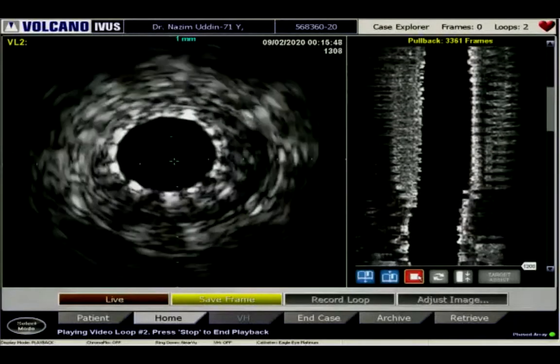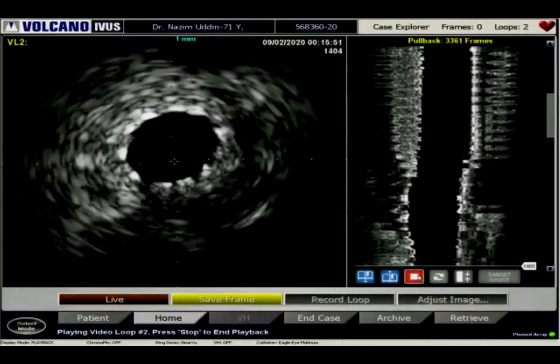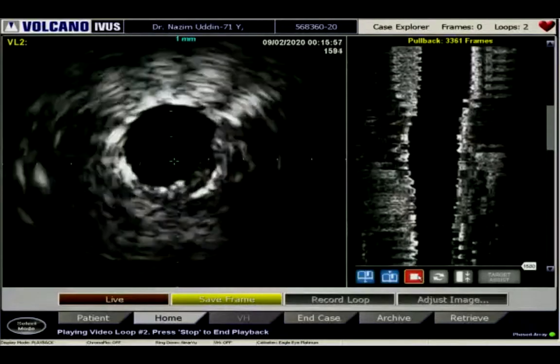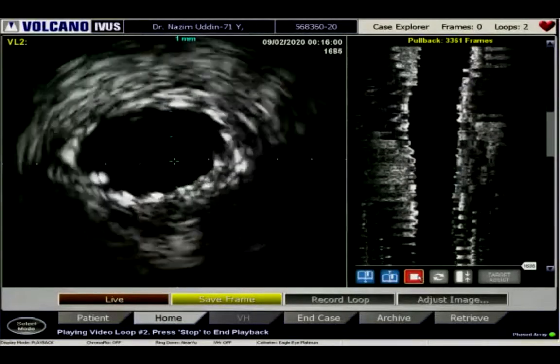But the machine, in the morning they checked the machine, it was fine. And right now, it's sort of creating problems. So we've taken a 4.5 by 8. So we are done. Traditionally for a CKD patient, maybe IVUS would be a safer option, right? Like in this patient, we have to use IVUS. But I feel that with OCT and angio co-registration, you don't really have to use extra dye. While you're taking the shots for the angiogram, you can see the OCT as well.